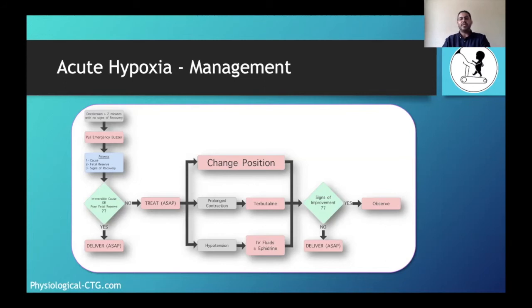If the variability is still flat, the problem is that the parasympathetic is now switching off. Parasympathetic has no tone. Remember, we said that parasympathetic only has responses. So the baby has a prolonged deceleration because of the parasympathetic slowing the heart down, because of the prolonged cord compression, or because of the hypotension.